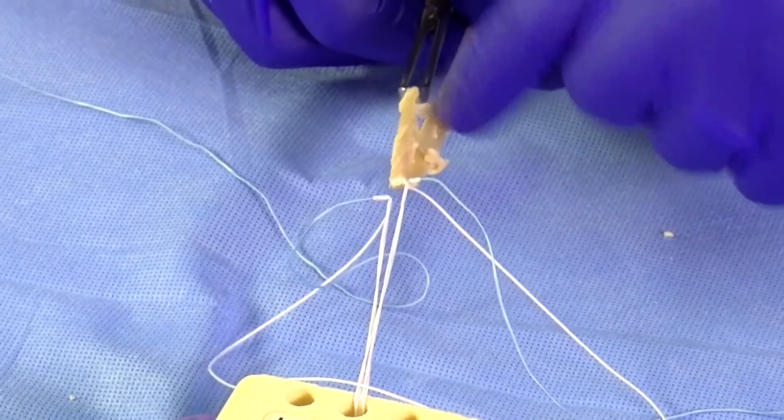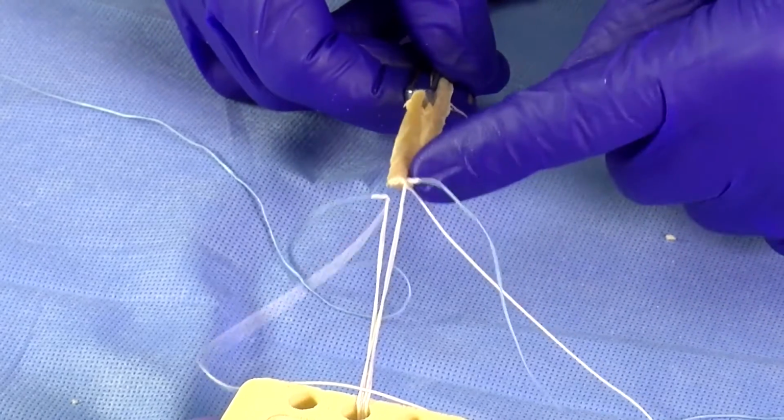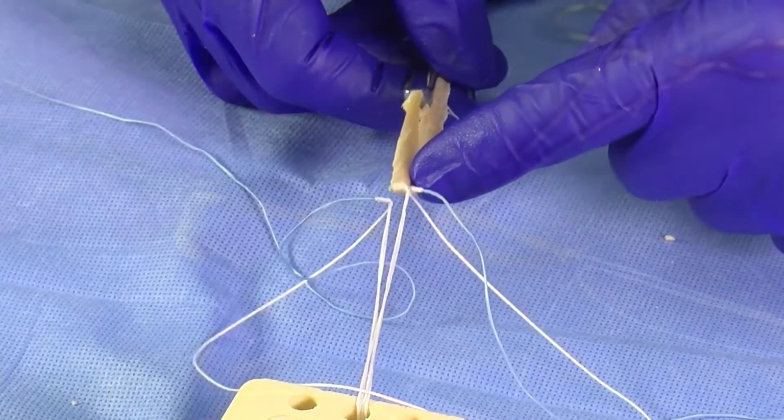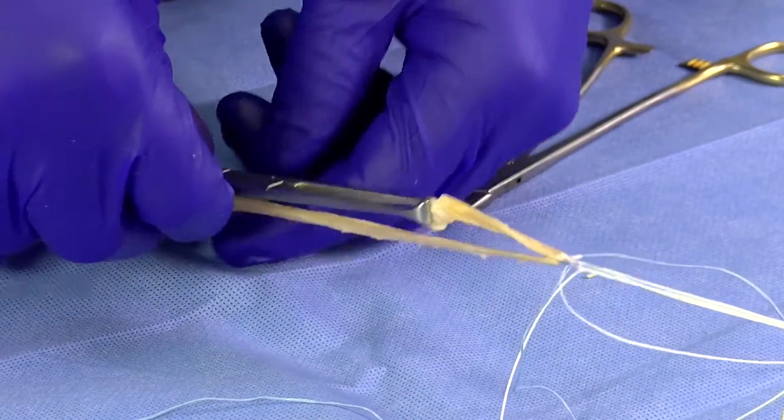This is essentially the intra-articular portion that you're going to excise, and generally you do not want the musculotendinous junction to be here at the implant. I think if you're doing that, you're over-tensioning.